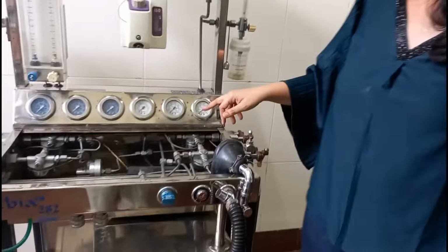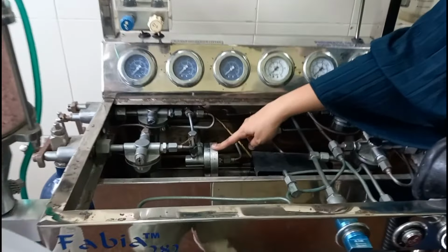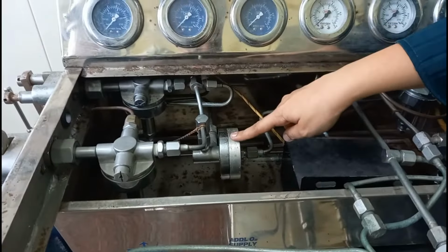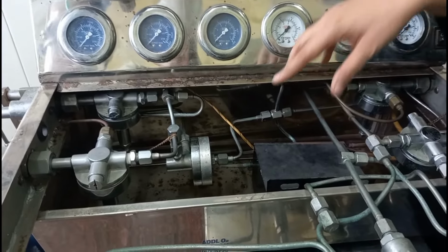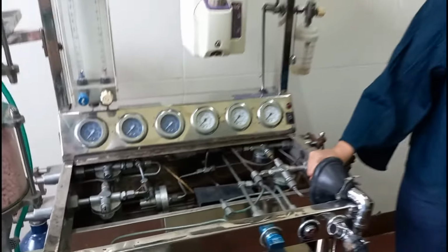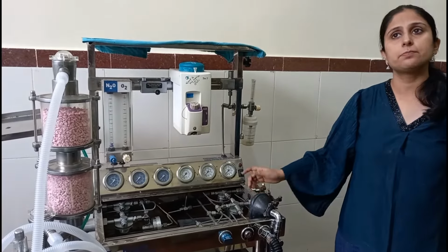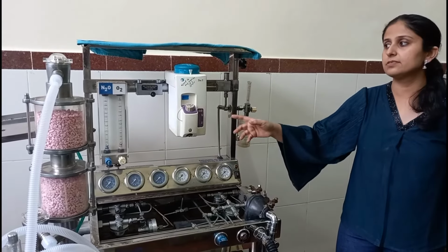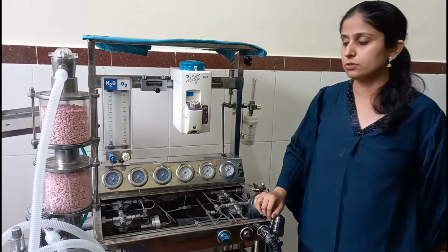Again, this is also a safety feature of the machine: the master-slave mechanism of nitrous oxide and oxygen, so that the patient does not have hypoxia. The Ritchie whistle and the oxygen fail-safe device are all preventive measures so that the patient does not get hypoxia. Apart from these, there are other safety features, like those in the pipelines we discussed, cylinders, vaporizers and the pressure reducing valve. These are all the safety features of the machine.